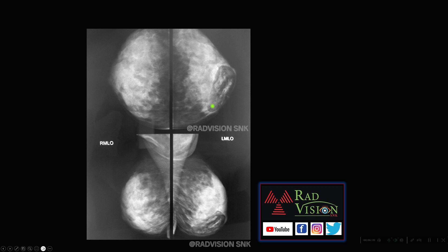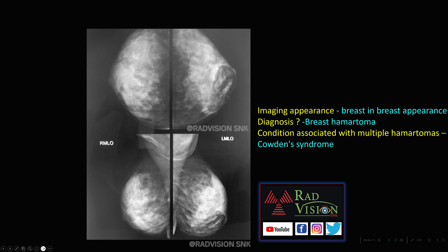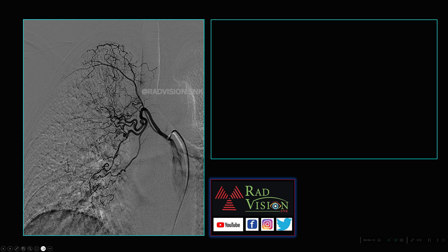Next case: this classical appearance is called the breast-in-breast appearance. The diagnosis is breast hamartoma, and the condition associated with multiple hamartomas is Cowden syndrome. This may be asked in viva.